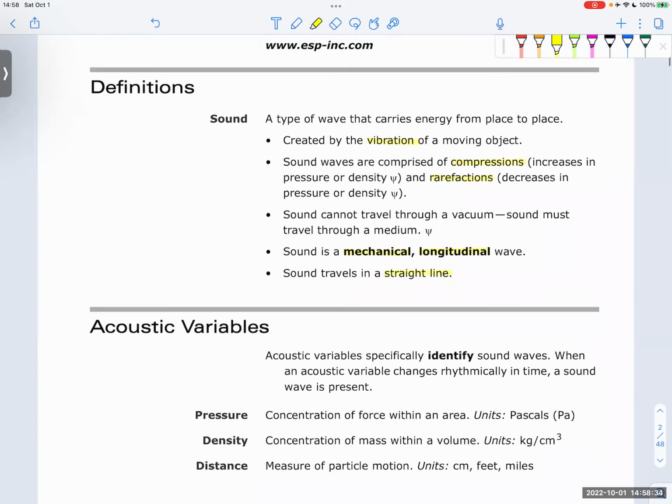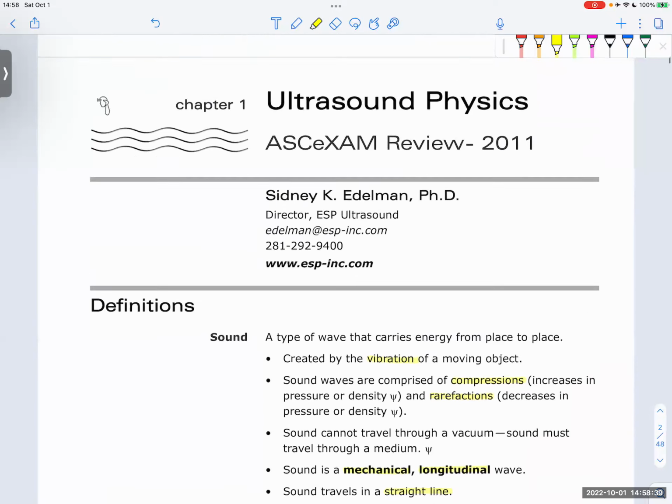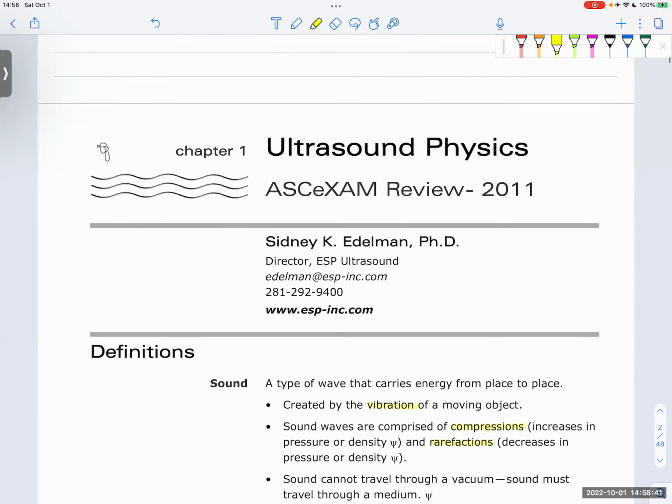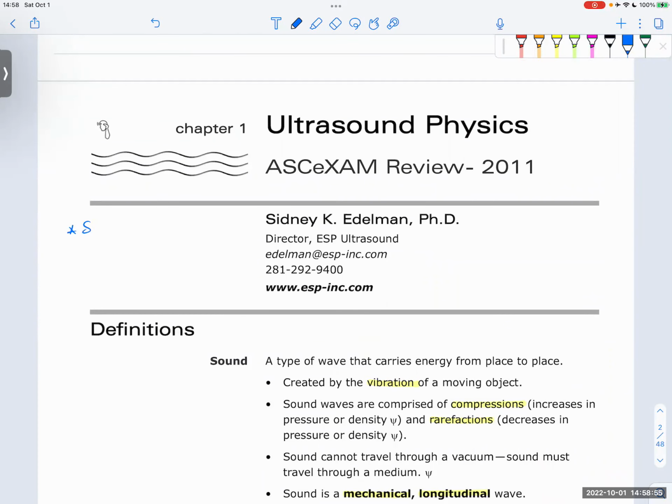Okay, now, before we describe the wave itself, just to know what ultrasound itself means. It's going to come shortly, but I think it's very important to be on the same page. So the word sound itself describes, we can mention here, that sound is characterized by a frequency.